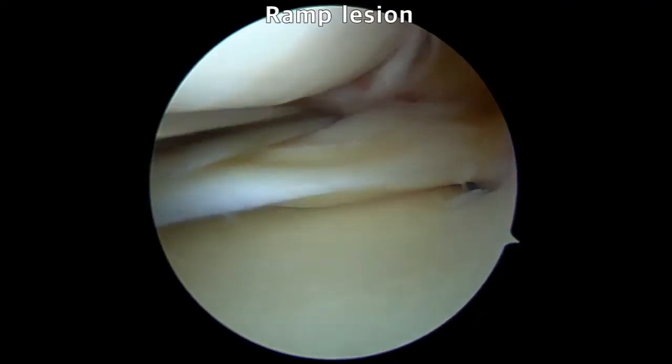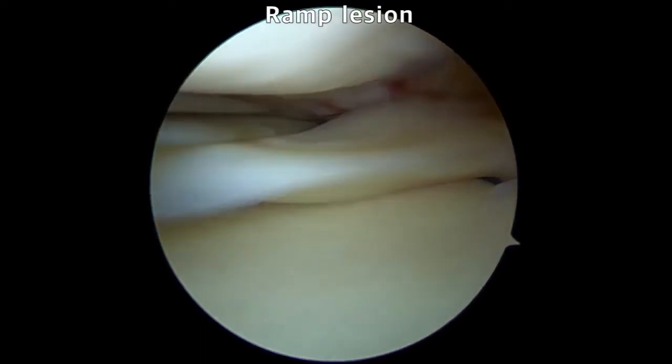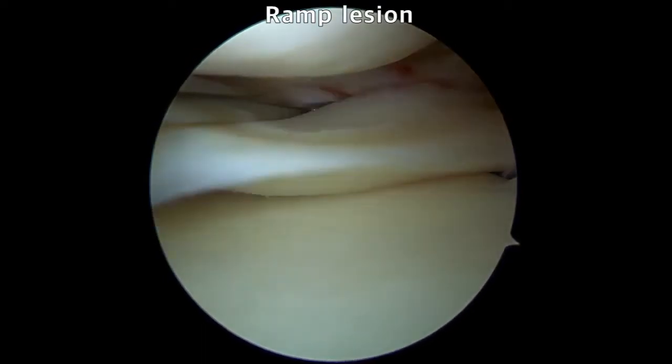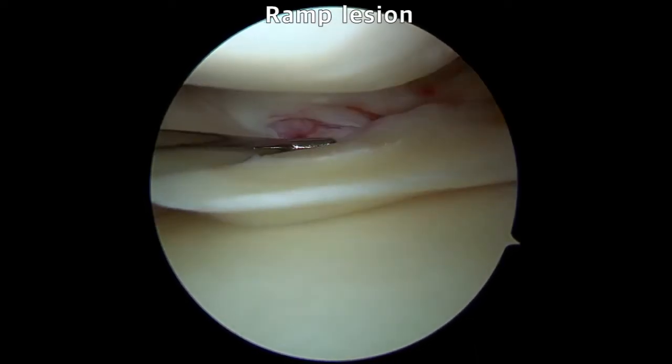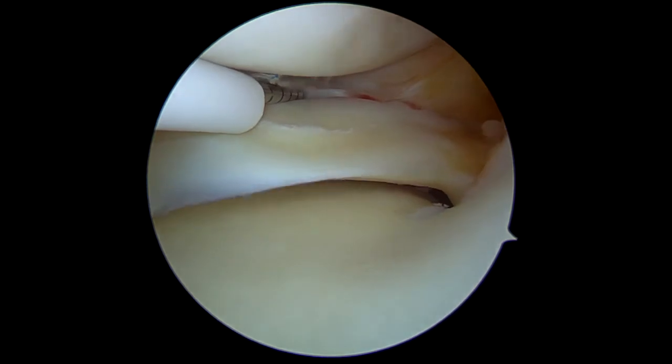As a result, the ramp lesion can be fully visualized from the anterolateral portal, and the probe or FASFIX needle from the anteromedial portal can approach the posterior medial meniscal capsular junction without any other assistance.